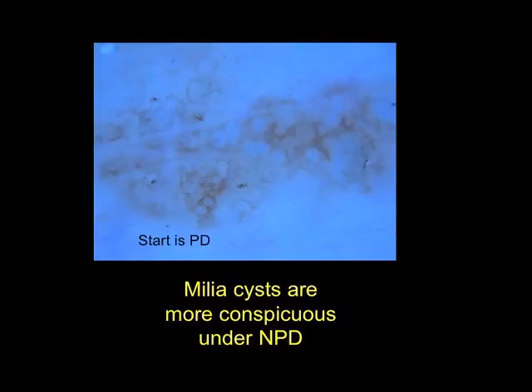And so I have a scope that allows me to toggle between polarized light and non-polarized light. We are starting by looking at this image with polarized dermoscopy. Now if you start the video, you will see as I toggle, the milia cyst come in and out of view.